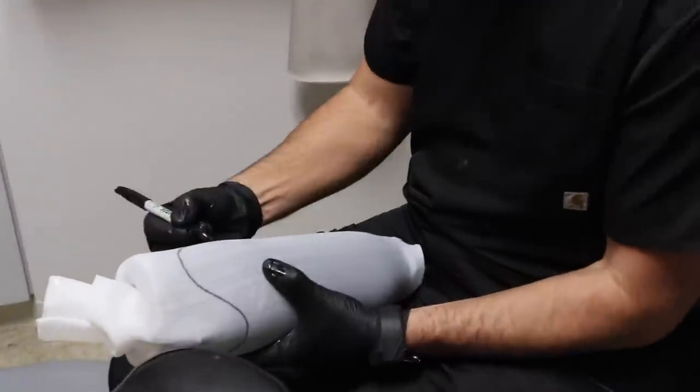Now the direct socket is complete. They pried it off of me and now they're going to do their magic back in the lab to actually make it into a functioning socket. It does not feel good when they pull it off like that, but they did a great job.